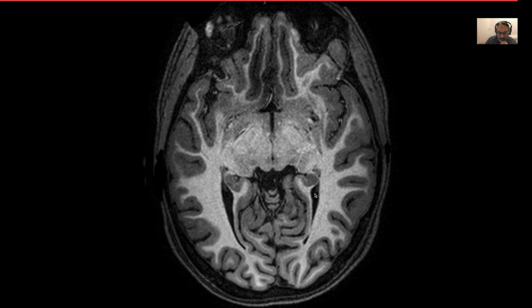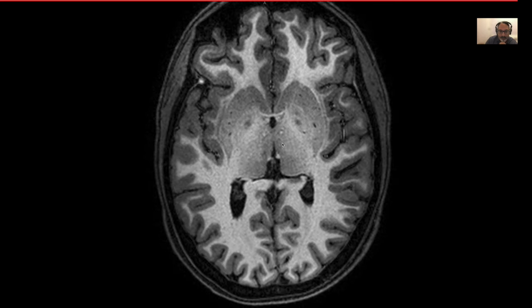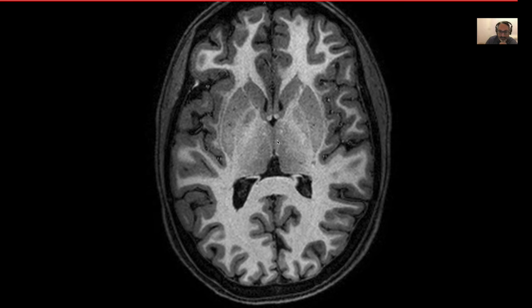Now you can see the occipital part of the lateral ventricles. That's the temporal lobe. These are the Sylvian fissures. So that's the temporal lobe. And then as we keep moving upwards, that's the temporal lobe. Now that temporal lobe is slowly going to start ending.